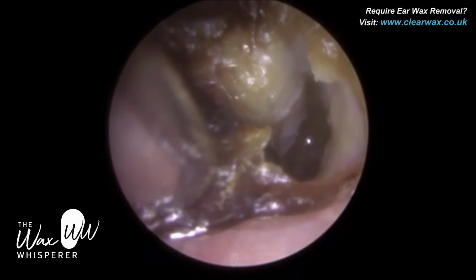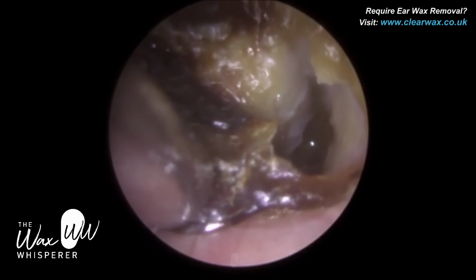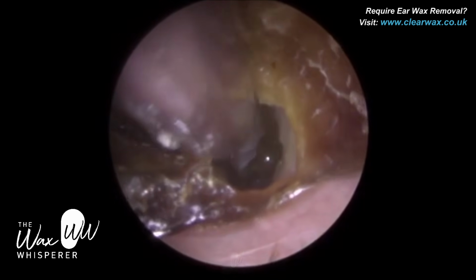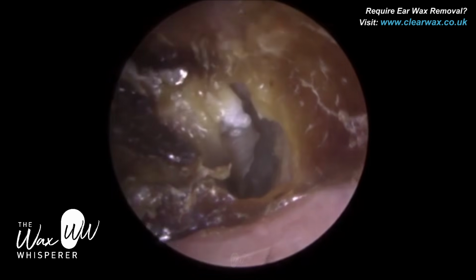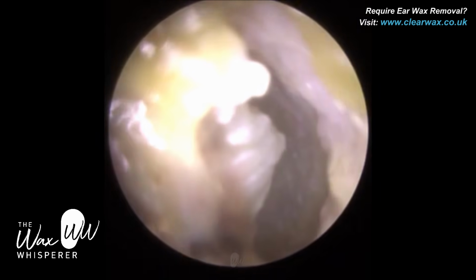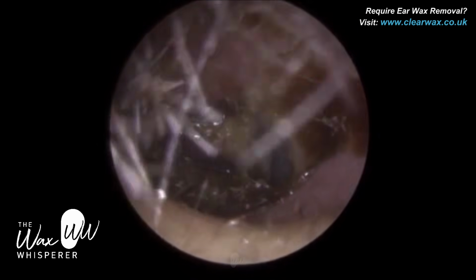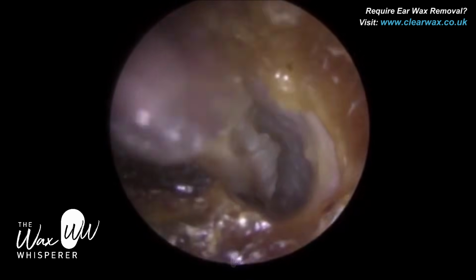So whilst you're watching this, I'm going to explain what a cholesteatoma is. So a cholesteatoma is a collection of dead skin, so keratin, that usually collects at the top part of the eardrum. So when your eardrum is retracted or inverted, so sucked inwards, buckled inwards, it normally gets sucked in at the top of the eardrum, and that's called the attic. We also call that the pars flaccida. So that region of the eardrum is very, very mobile, very thin compared to the main body of the eardrum, which we call the pars tensa.